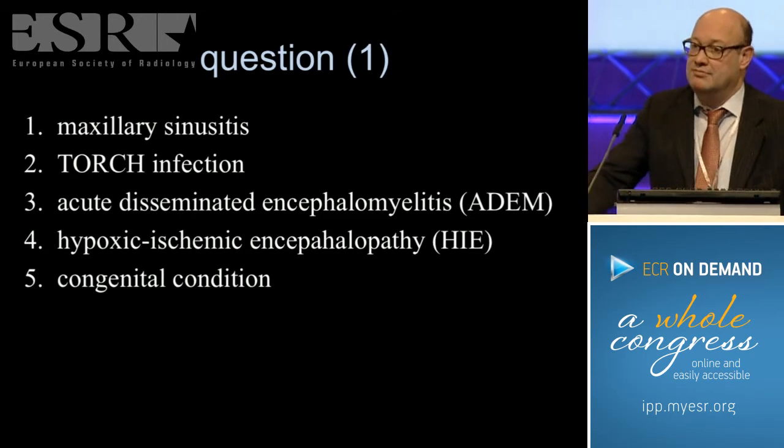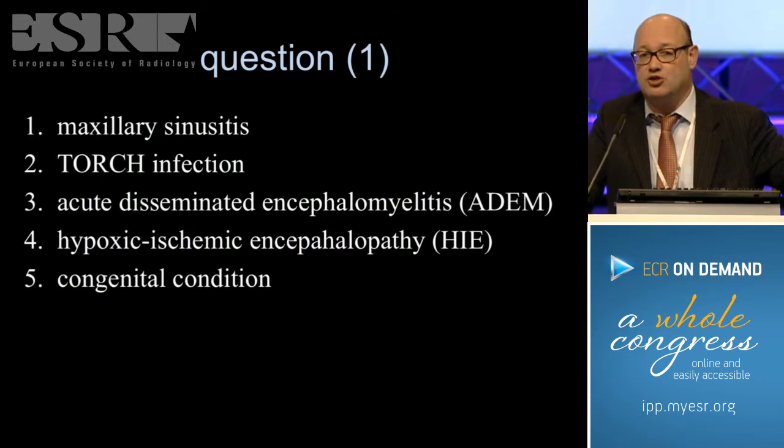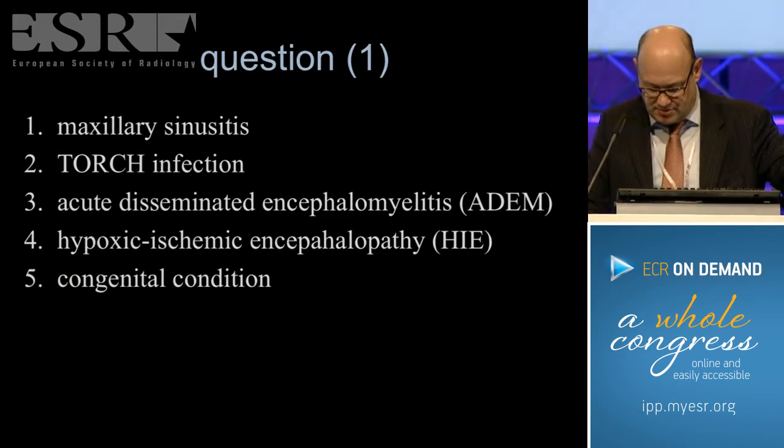Maxillary sinusitis, a TORCH infection, we deal with acute disseminated encephalomyelitis as a complication of the varicella infection, we deal with hypoxic ischemic encephalopathy, or we deal with a congenital condition.